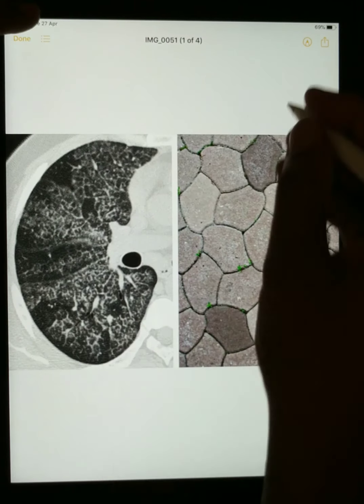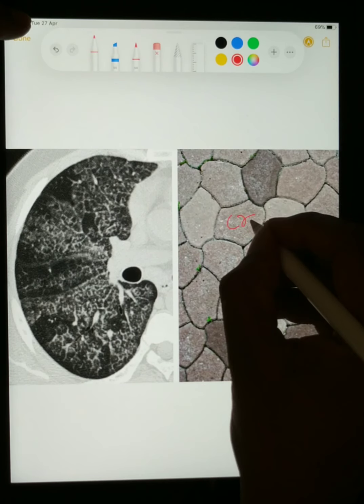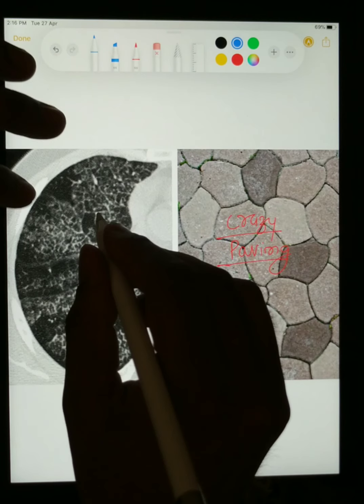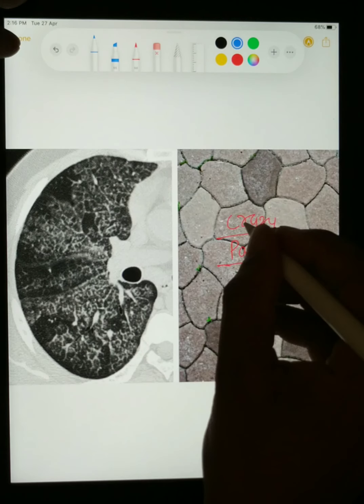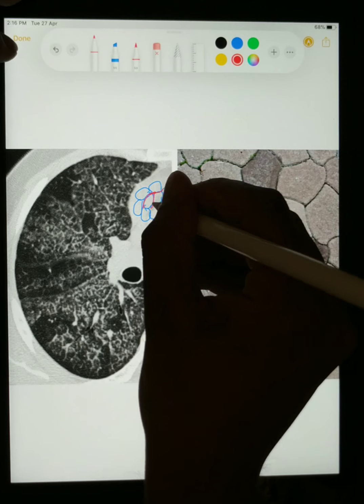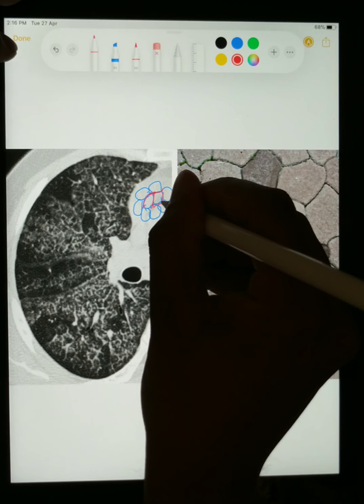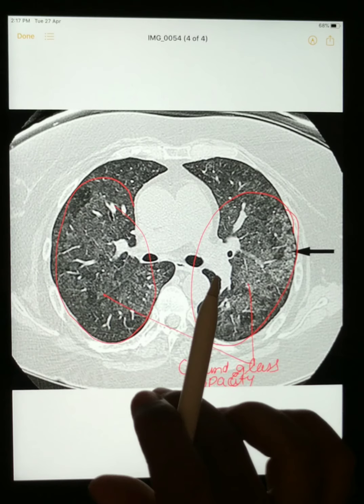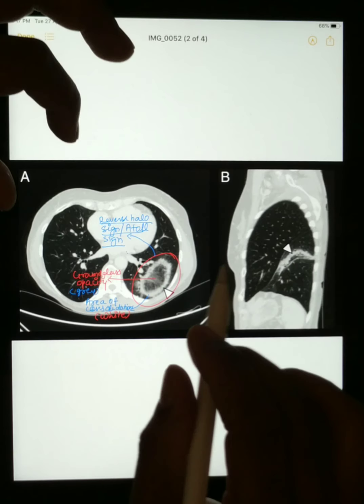And finally this is the picture of crazy paving pattern. This pattern is also typical of COVID-19 pneumonia. In this pattern there are interlobular thickenings — the lung has multiple lobules and in between them there are septa. You can appreciate these red markings are the septa. If there is thickening of these septa, this will appear like crazy paving. Now you can easily appreciate: the area of ground glass opacity is a mixture of white and black — grey. The area of consolidation is completely white with air bronchogram sign. The reverse halo or atoll sign is an area of ground glass opacity surrounded by consolidation. And the thickening of interlobular septa appears as the crazy paving pattern.